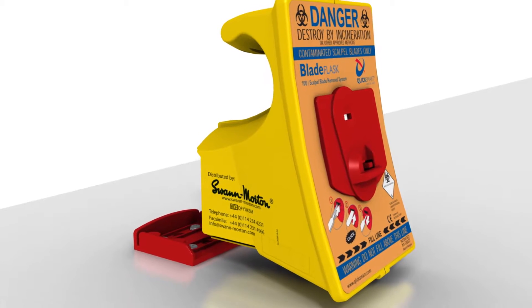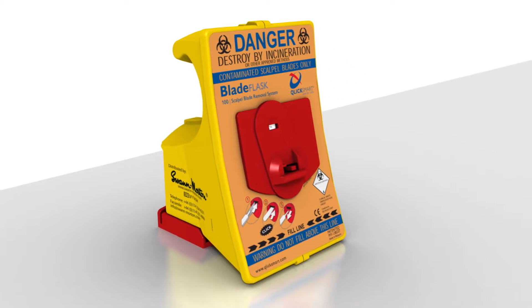Once the bracket is in place, the blade flask can easily and securely be attached to the bracket.